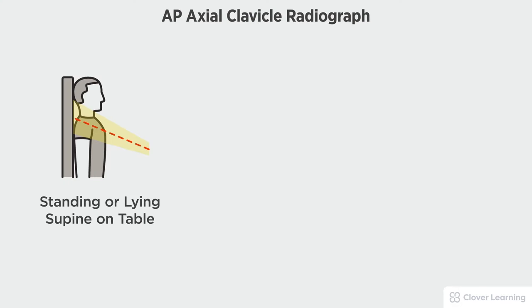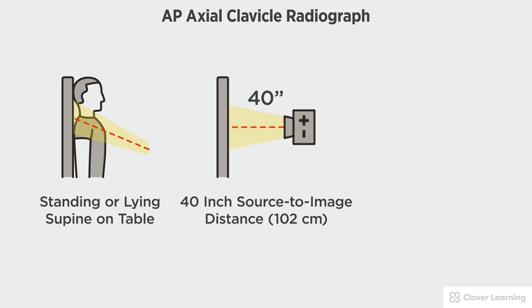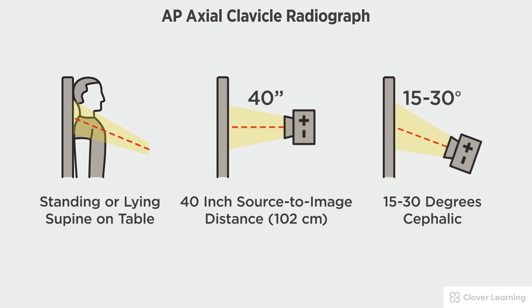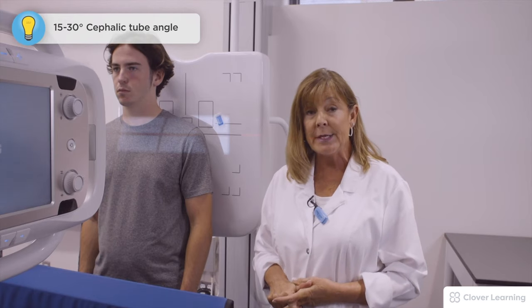In this view we will be demonstrating the AP axial clavicle. The AP axial clavicle should be performed with the patient standing at the upright bucky or lying supine on the radiographic table with a 40-inch source to image distance and the tube angled 15 to 30 degrees cephalic, depending on the patient's body habitus.